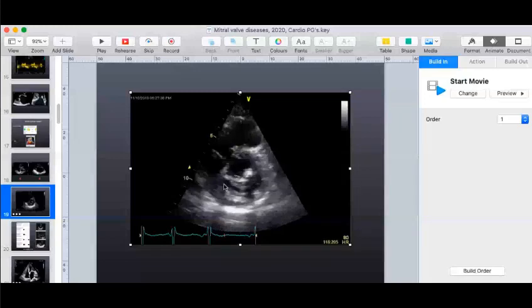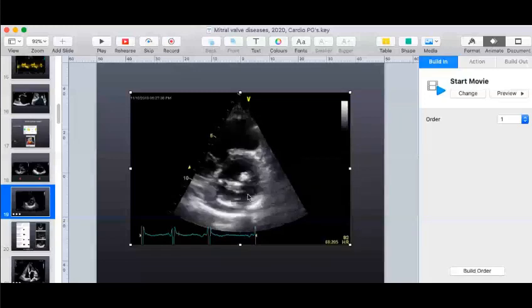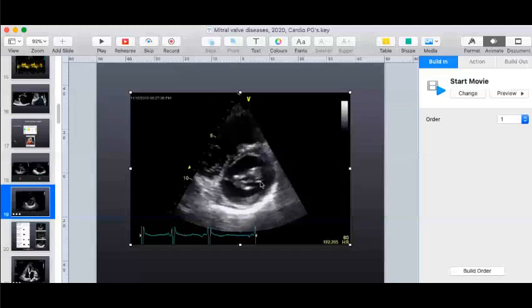This is outside. So this is the posterior mitral annulus, which is calcified in a very small manner. And then there's part of the anterior mitral annulus also, which is calcified here. But the main message here is there is a commissural calcification. So how would you describe commissural calcifications a little more?